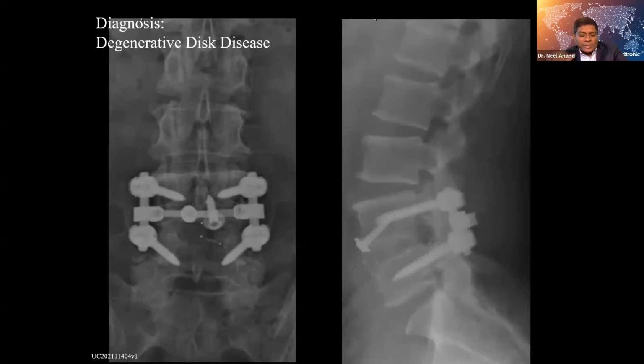No, I agree. Like you said, the surgeon did a great job getting a fusion. The instrumentation is great, interbody is great, but I think he didn't pay as much attention to getting the lordosis. And L4-5, as we know, needs a good 15, maybe even 20 degrees of lordosis. I think that's where the issue is, and the effect is seen at L3-4. And I think we learned so much about it, and we've all been prey to this, and we've all done it ourselves. But I think that reaction at 3-4 speaks for itself with the retrolisthesis there because of the lack of lordosis.